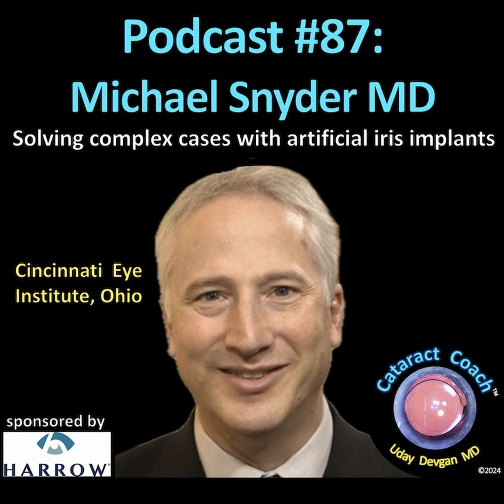Right. I do tend to hunker down for these cases. I don't plan on them being a 10-minute case. I plan on being in there for a little bit. And even if the zonules are totally normal, I'll put a ring in anyhow. There's some conflict as to whether putting a ring in reduces the incidence or rate of subluxation. Sure. And I don't know whether it does, and I don't know whether it doesn't.